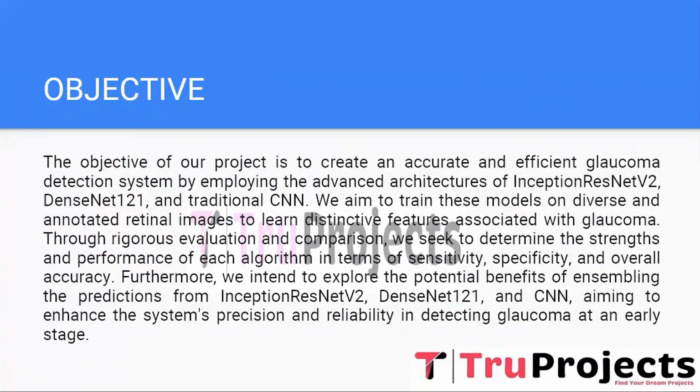Additionally, we will explore the potential benefit of combining the predictions from Inception ResNet V2, DenseNet 121, and CNN using an ensemble approach to improve the system's precision and reliability in early glaucoma detection.